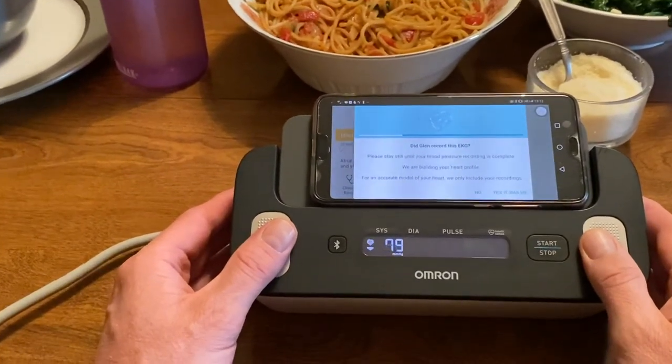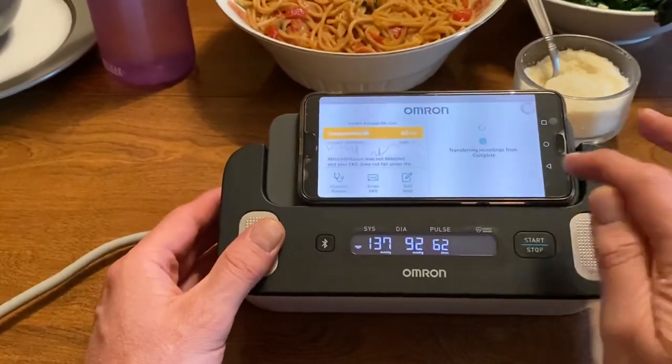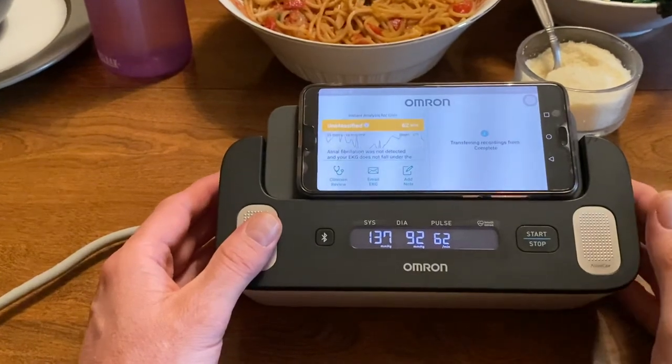It now asks if I want to record this. Yes, it was me, and it's now recording that information.